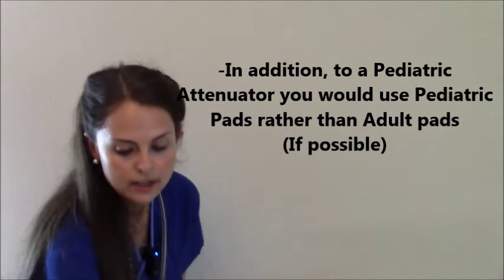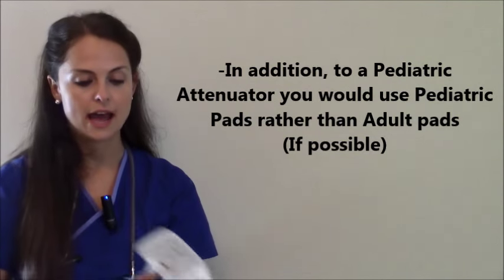And let me show you the difference. Right here we have some pediatric pads — they are smaller than the adult pads. These pads can be used for a child and an infant. Now compare these with the adult pads; they are a lot larger.